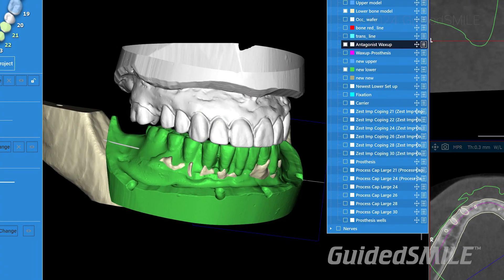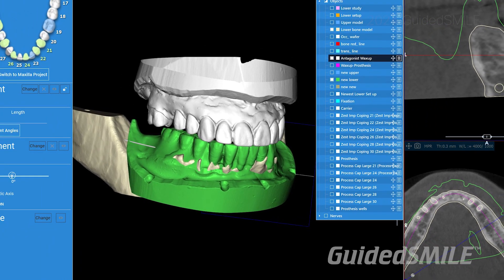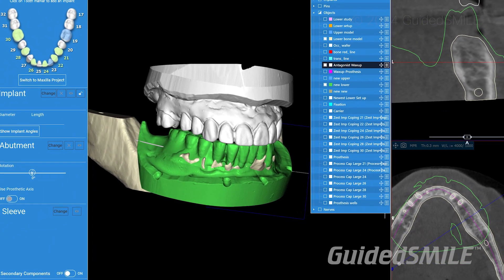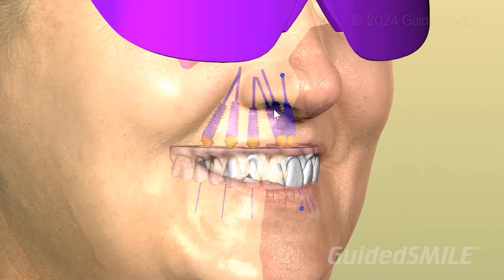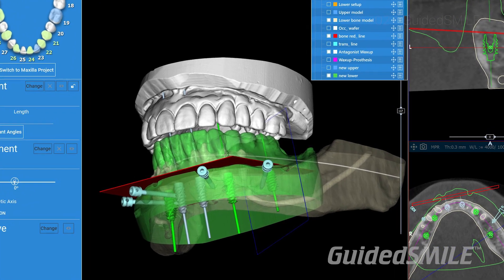Take control of your full-arch guided surgery. Guided Smile has developed a plug-in that works with the RealGuide software, allowing you to import your records, import your setup, perform a bone segmentation, plan your implants, plan your pins, plan your bone reduction, and get ready for the online meeting with the doctor.